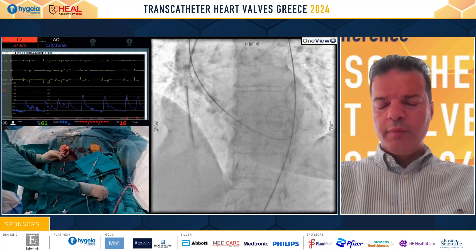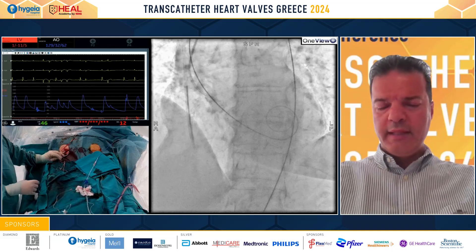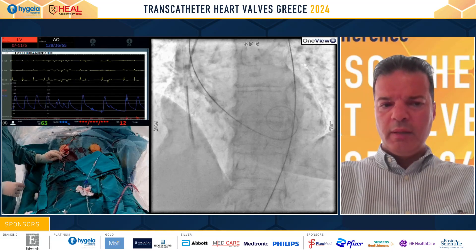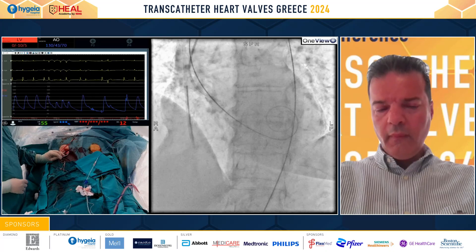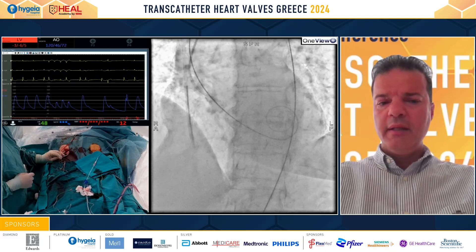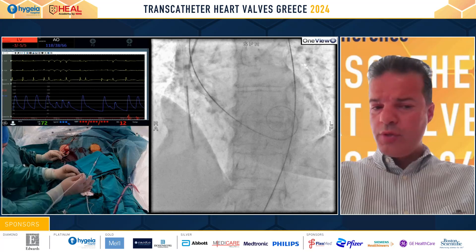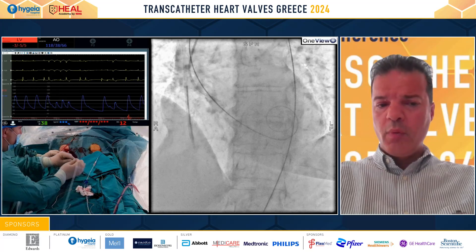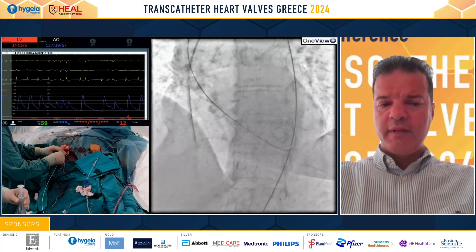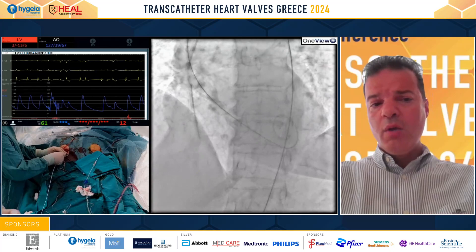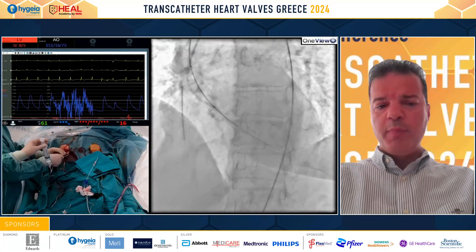The next step is to pre-dilate the valve using a 20mm balloon under rapid pacing. We don't use a temporary wire for pacing because this valve has a very low probability of requiring one. We would only use a temporary wire if there is a pre-existing right bundle branch block.